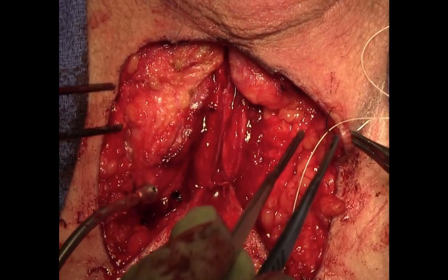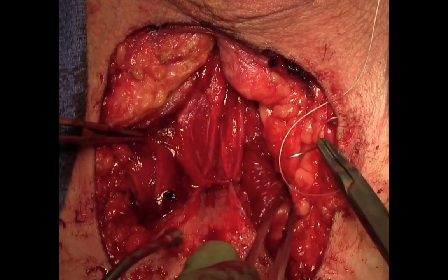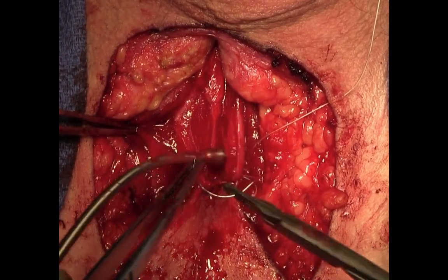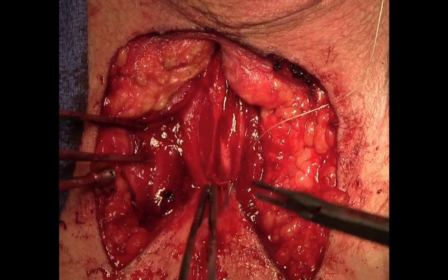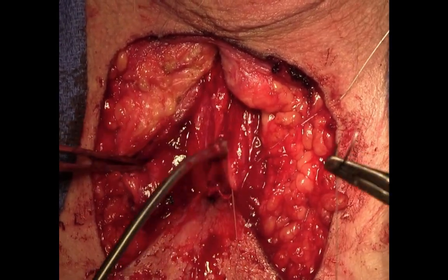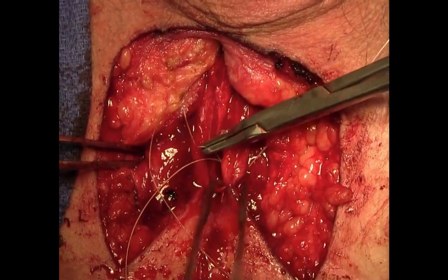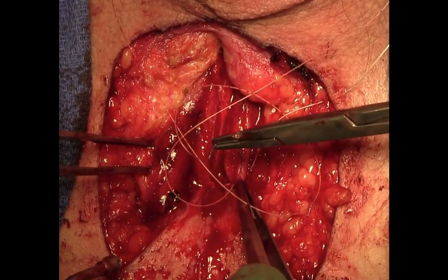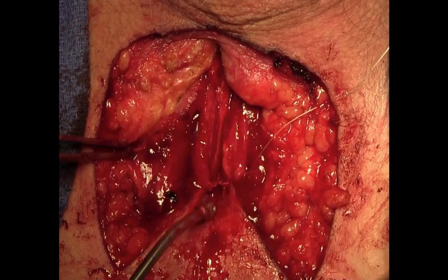Now the lateral aspect of the perineal skin is brought down to the urethra. The scrotum is always very loose and can be easily brought to the urethra. However, a large disparity is created between the advancement flap and where the lateral perineum is brought down. It's better to pick a spot below this where there's less of a dog ear created, but there isn't tension. A U stitch is used in order to bring the lateral perineal skin to the urethra and then to the advancement flap.